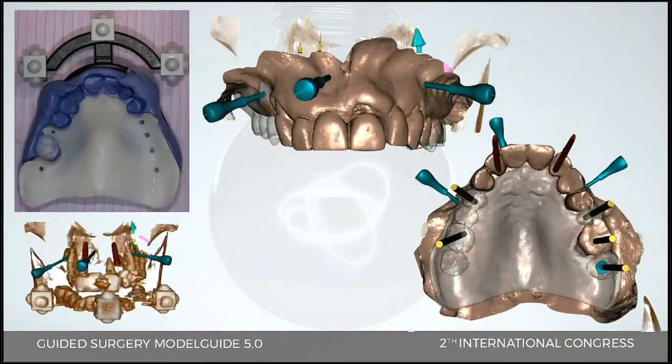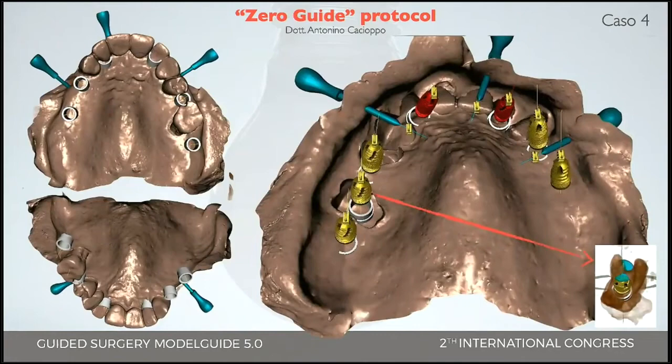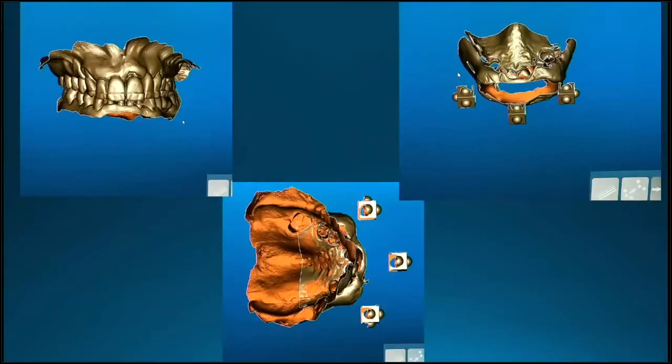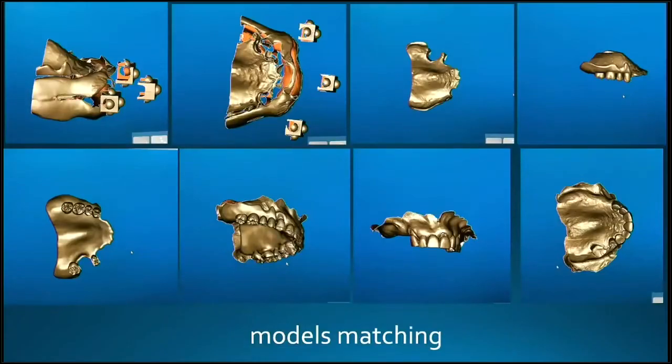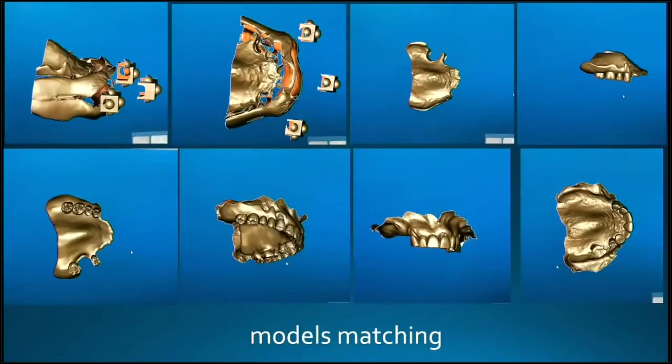And after that we undergo the CBCT examination, the project, everything in digital, and everything to the lab, 100% digital. And on the lab side, with my technician, we maintain all the occlusal values that I managed on the intraoral side with the try-in and with the Teethan.